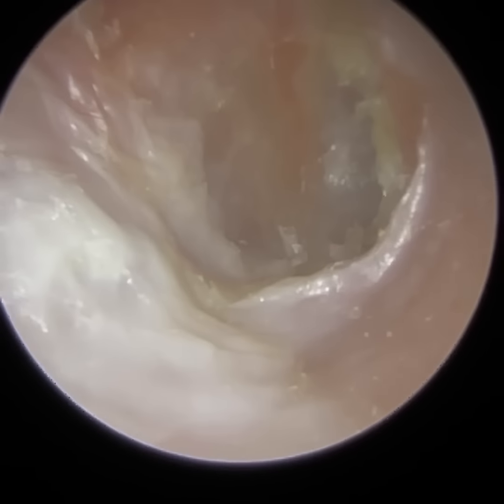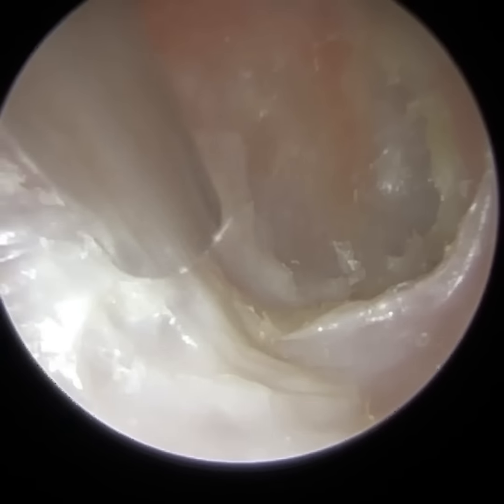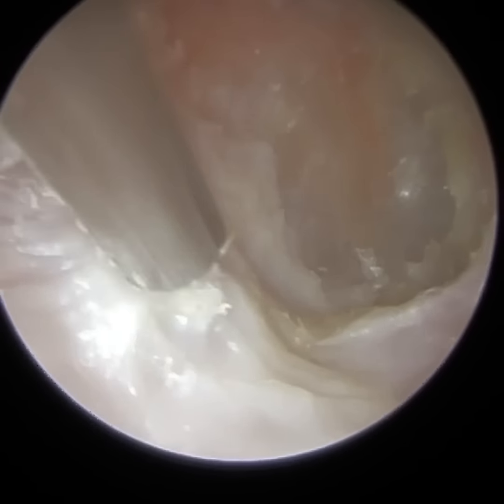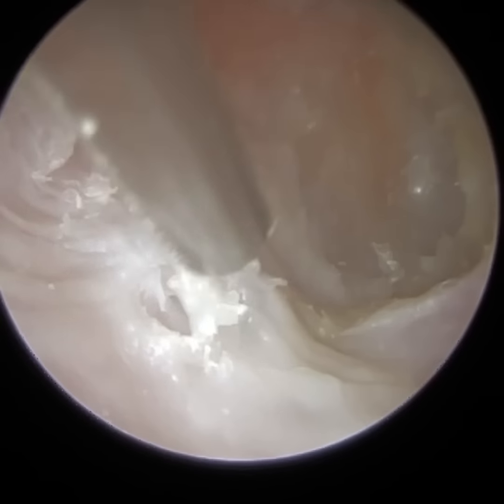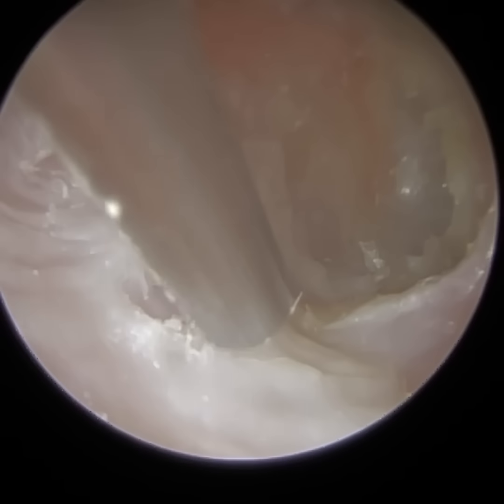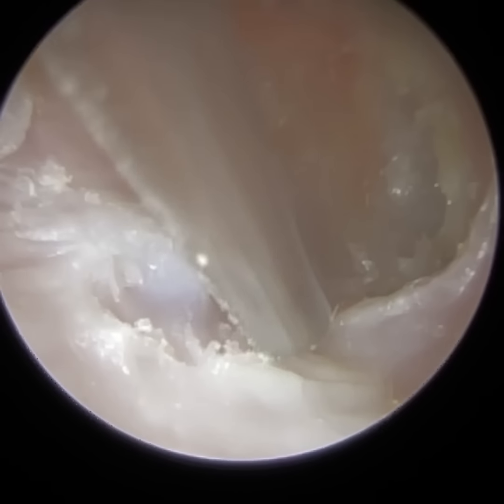Or maybe in the past this patient did suffer from keratosis obturans, and it's a remnant of that. But with keratosis obturans, you typically get more global widening, so it's not localized normally. I mean, there's always going to be individual differences, but it's not just at the back part of the ear canal, it's the whole perimeter.